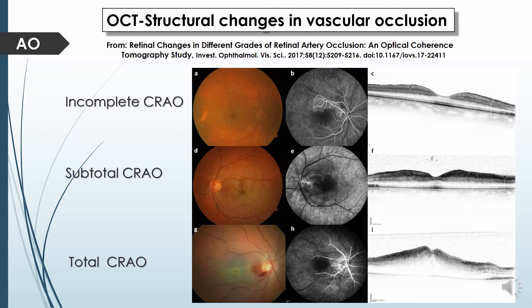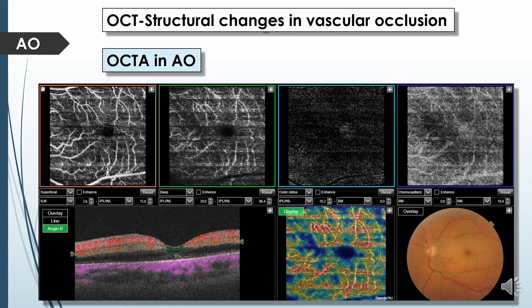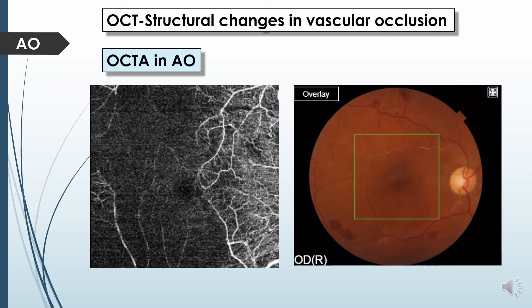OCT angiography in central retinal artery occlusion may carry artifacts such as motion artifacts due to improper fixation or projection artifacts in the deep capillary plexus due to significant hyperreflectivity of the inner retinal layer. In a patient with occlusive vasculitis secondary to Behçet's disease showing multiple arterial occlusions, OCT angiography demonstrates a big difference between the perfused and non-perfused areas.